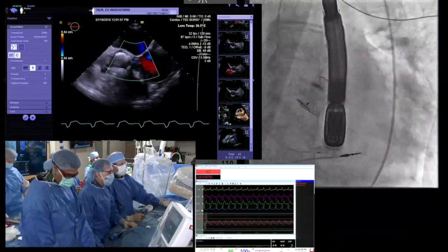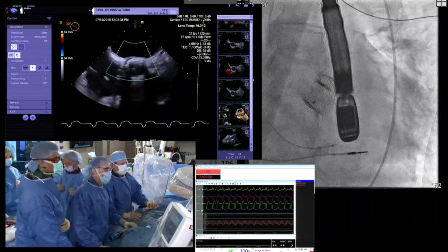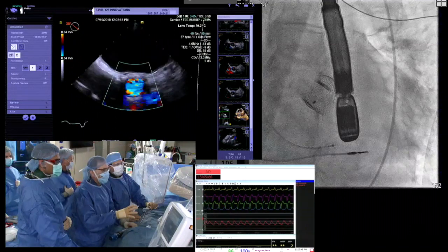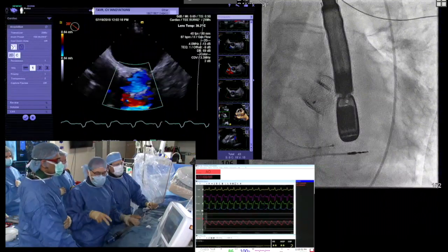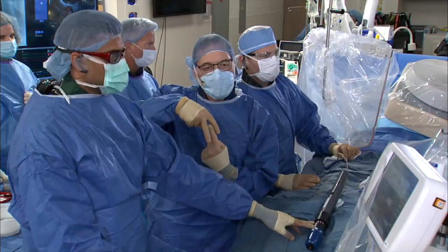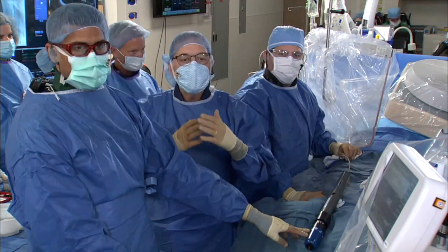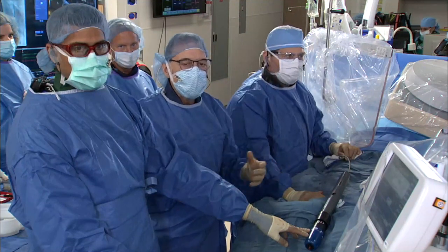Yep. And I love, maybe one of the panelists could comment, the symmetry on top and bottom of the braid density. Even though this is a little barrel-shaped from paucity of calcium on the aortic valve complex, the braid density is very symmetric. Now, if it were asymmetric, like sometimes we see with the bicuspid, still, that doesn't affect the function, because the leaflets are sewn in between the legs of the tuning fork. So even if the braid is a little impacted or impinged on by the calcium, it doesn't affect the valve function. And I think that's another reason we see such terrific PVL rates with this device.